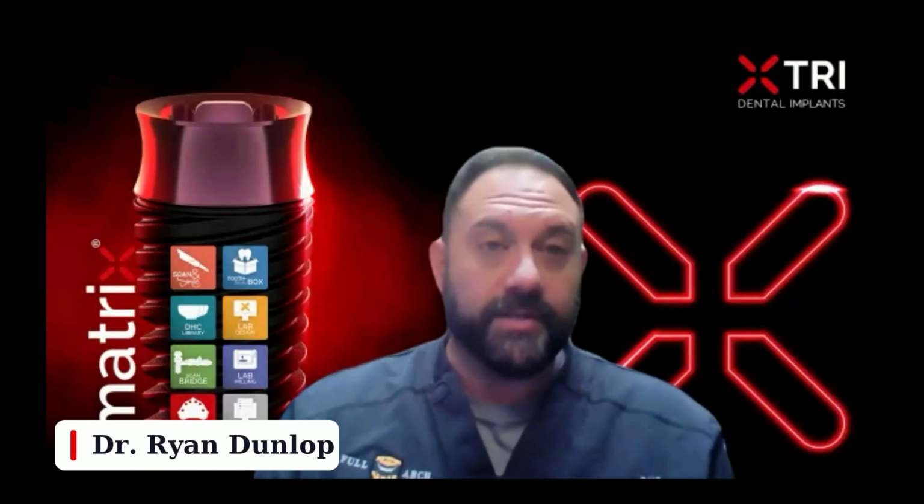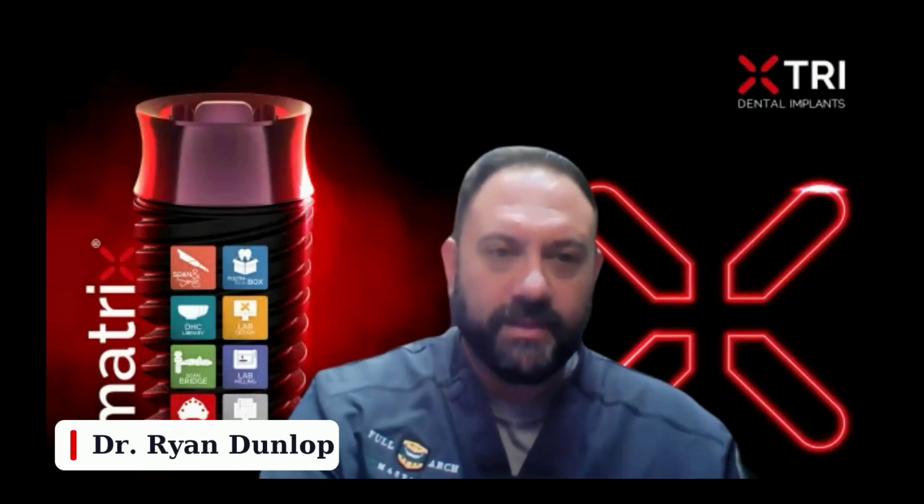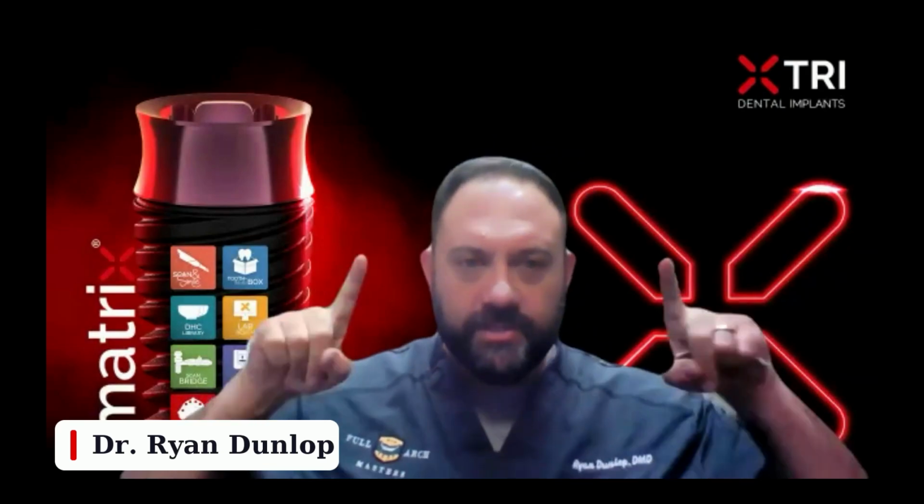Any issues with path of insertion with full arch? Yeah, that's a great question. The simple answer is yes, there can be. If you think back to my case, I had 2 tilted implants in the back and 2 straight implants in the front, and the angle of divergence between those two is probably 40 to 50 degrees. What you create is a path of insertion problem if you were going deep into the implant. So if you're going fixture level with a traditional bone level implant, you would never have a path of draw for that prosthetic.